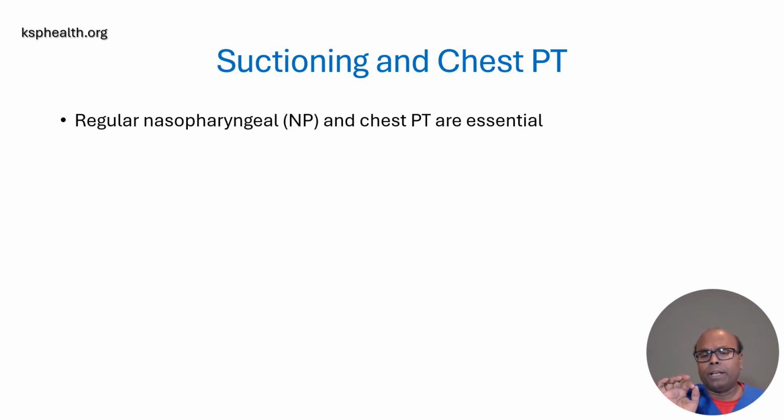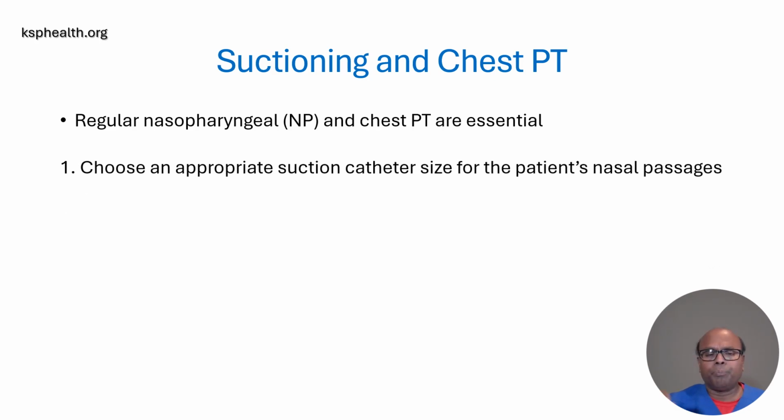Regular nasopharyngeal suctioning and chest PT are very essential in the care of these patients. Choose an appropriate suction catheter size for the patient's nasal passages. Lubricate the end of the catheter. It's very important because we commonly find irritation from the suction catheter.